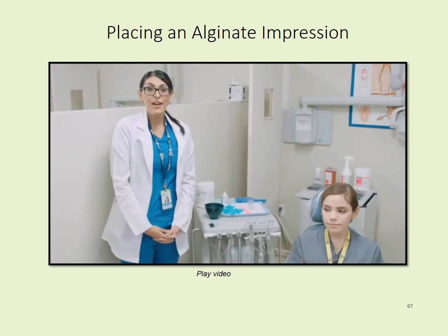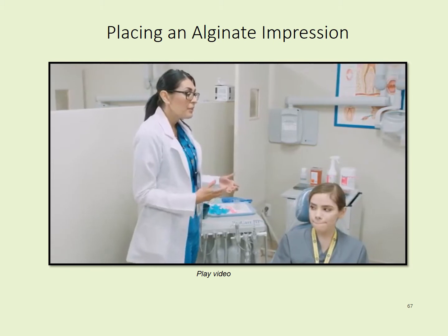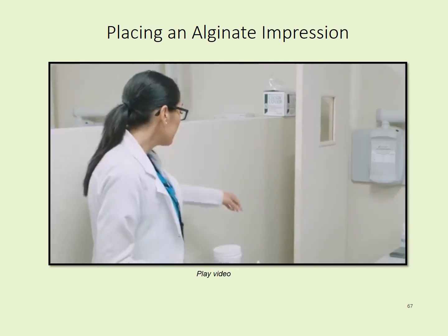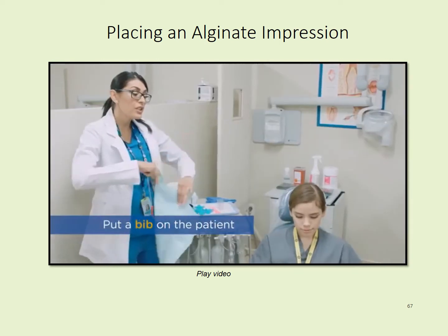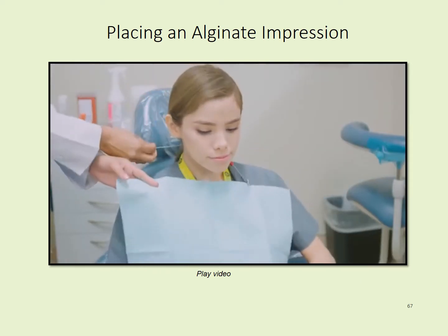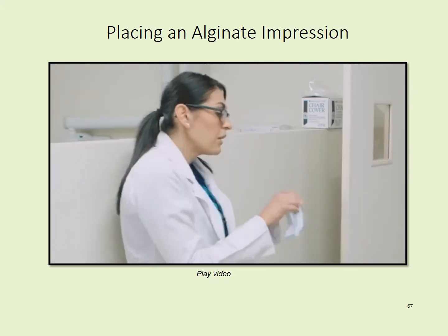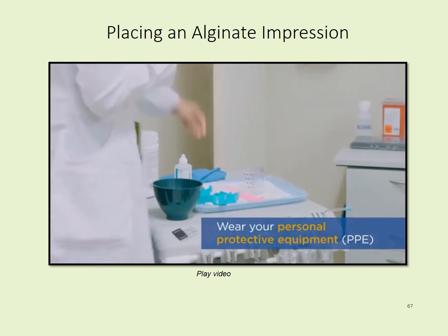Alright, so now we're going to do our alginate impression on our patient. This is going to be an alginate impression demoing the maxillary arch. So we're going to do a simulation, and we have Heaven, our student, volunteering today. The first thing you want to do is put a patient bib on them. We are doing an alginate impression in the mouth. Sometimes patients may drool, and sometimes patients will have a gag reflex. So we want to be sure that if anything happens, they're protected. So we are going to go ahead and place our PPE on, our mask and our gloves.